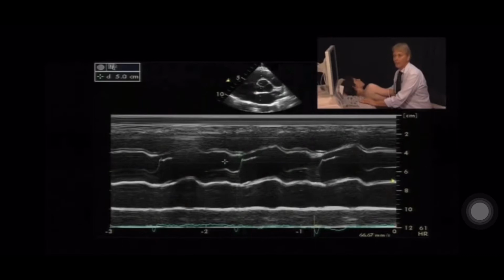What you can see very often is little fibrillations of the cusps, which is normal. Sometimes they're more, sometimes they're less. So this is not a pathologic finding. When we do the measurement, we perform it exactly at end diastole, so shortly before the aortic valve opens. So this would exactly be the best point to do the measurement.